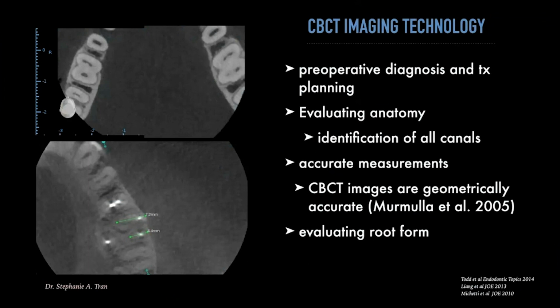So in endodontics, as well as in general practice, there are many times we want a better view of the exact measurements of all aspects of both the tooth and the bone. For example, our surgery colleagues, when placing implants, want to make very accurate measurements of both the angulation and the width and depth of the bone available to place an implant.